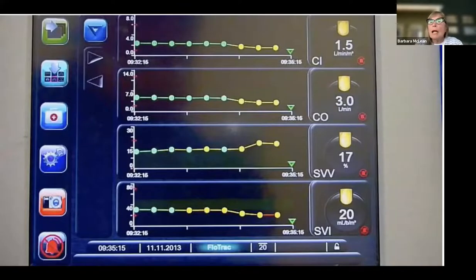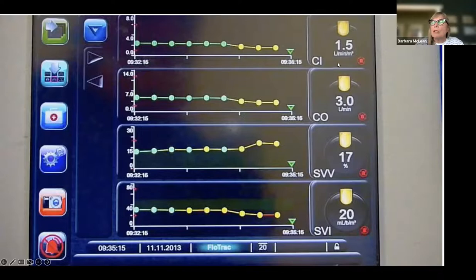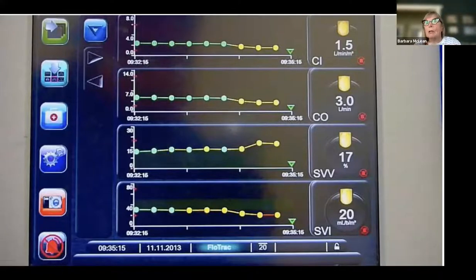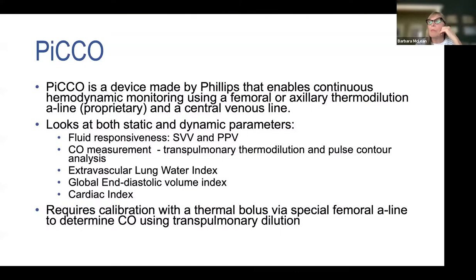Pre-volume administration you can see a low cardiac index, low output, low stroke volume and stroke volume index, with a high stroke volume variation — suggesting the patient is likely a fluid responder.